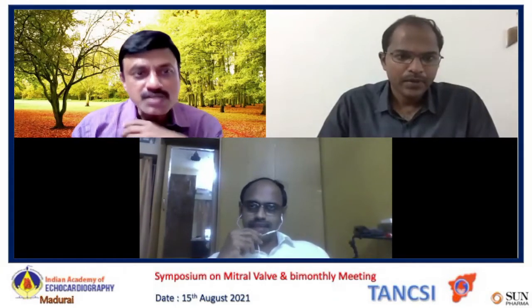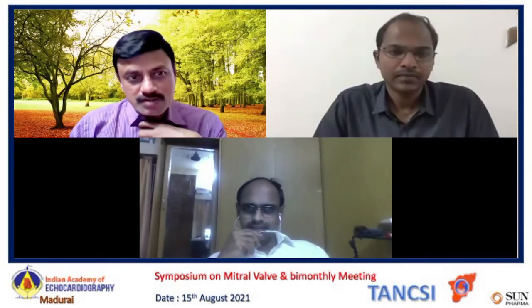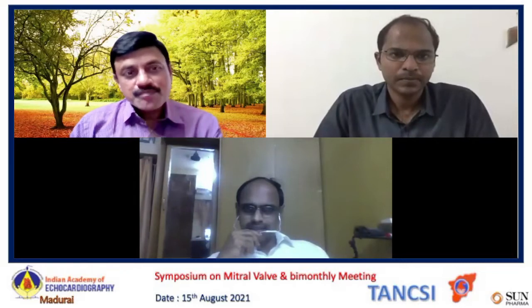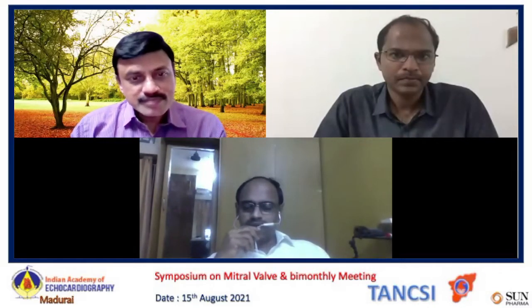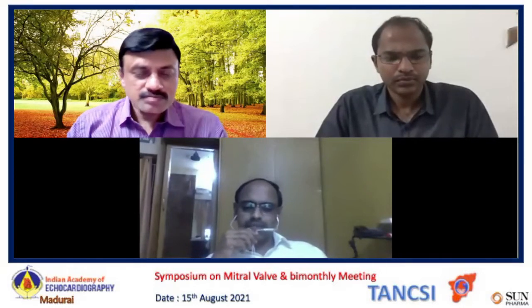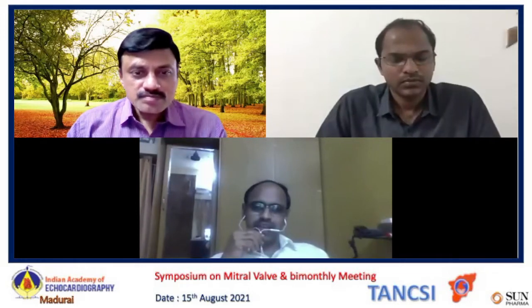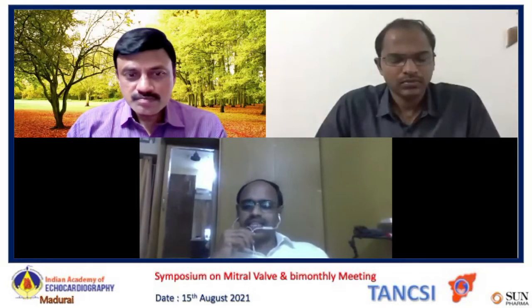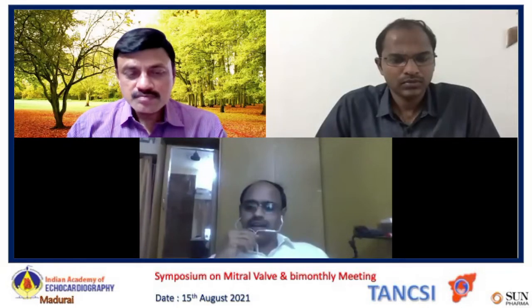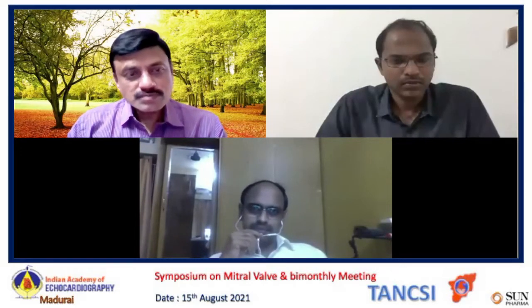We do see this being commonly done, valve-in-valve, prior prosthetic valve. We have done quite a few. Degenerating mitral valve prosthesis in patients who have a high STS score or high Euro score for a redo surgery will be candidates for a transcatheter mitral valve replacement. And now we are fortunate to have two different valves available on the shelf, which can be used in these patients.